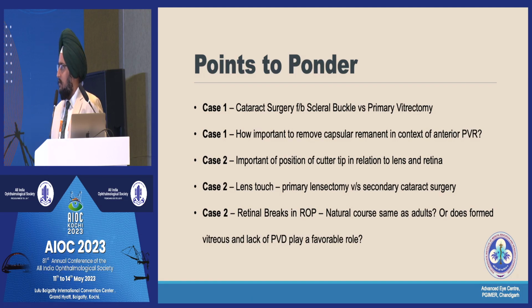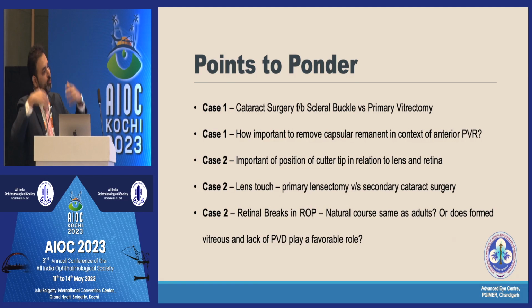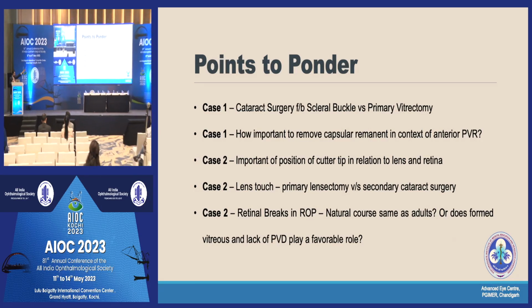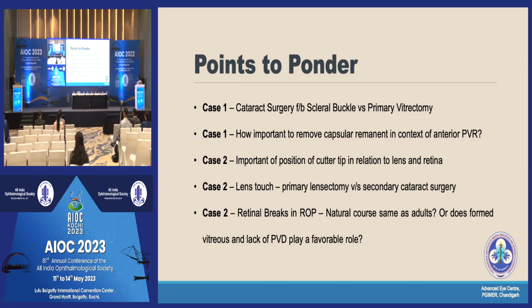Would you do laser? Because I think I might maybe miss that. Once the retina was attached, you had a favorable outcome. You could see the break. Would you do laser posterior to it, after the retina has settled? After one of the photos that you showed, when you could see the break just posterior to that remnant fibrosis, which was extramacular, would you want to augment some more laser or not? I think the laser was adequate. It was just at this edge of zone 1. I wouldn't want to come more inside.